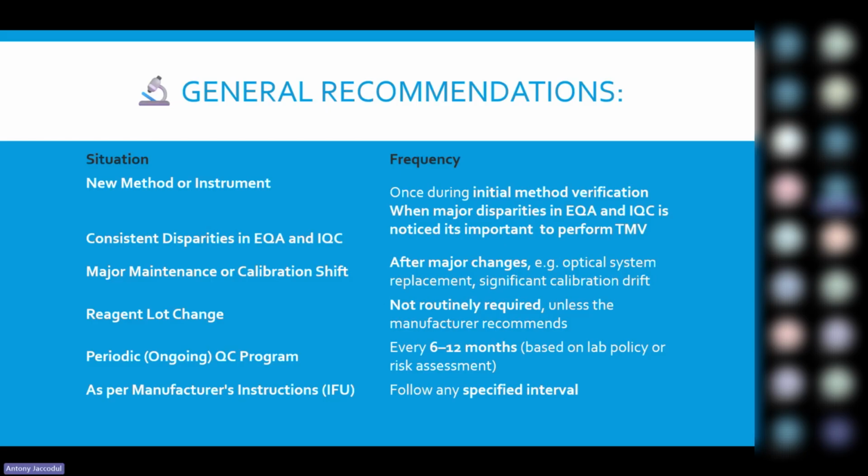So when do you need to do your carryover? When you've introduced a new method or a new instrument. When there are consistent disparities between EQA and IQCs, you need to look at whether carryover is an issue. When there's major maintenance or a calibration shift. Reagent lot: if you feel the reagent lot will affect it, or once you change the reagent lot and you're not seeing the expected results, you need to look at it.